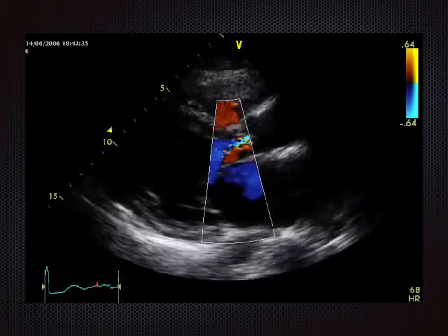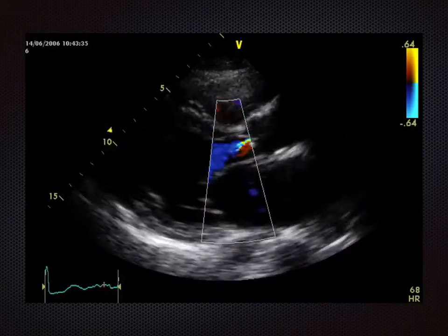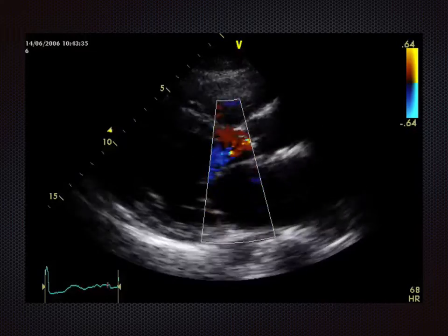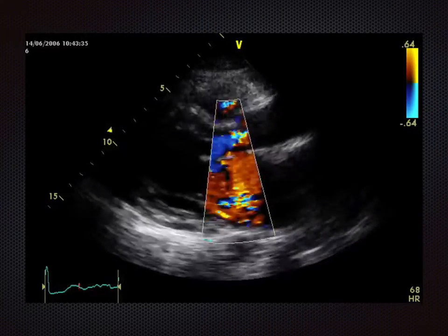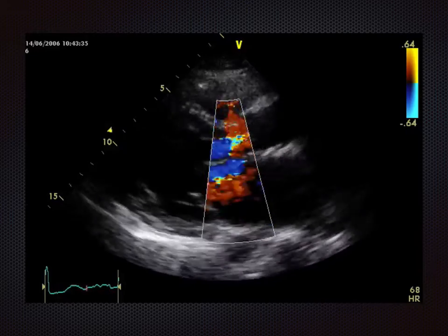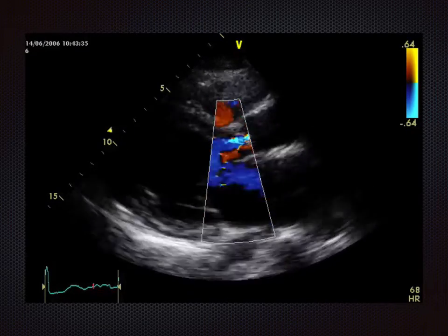The bigger the box, the more processing is required, and the more it can slow down the image that you're looking at. So it's preferable to have the box as narrow as possible, so you can just about see. Now you see both these, there's movement of blue and there's red seen, and there's also some turbulence flow where it's gone lighter and with little bits of potential greening.